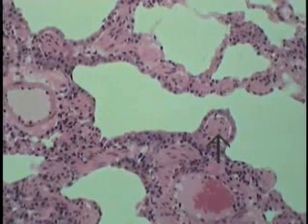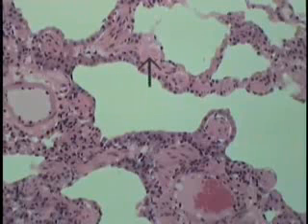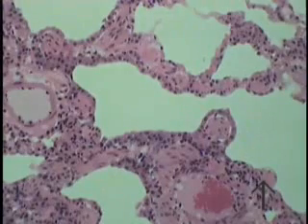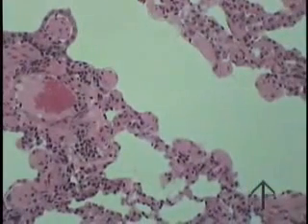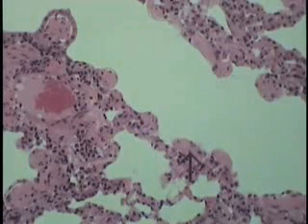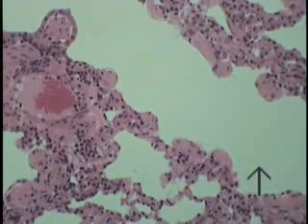There's another one here. This is a segment from an adjacent structure. There's another bundle of muscle here. And if we look on the upper surface, a bundle here, a little bit tangentially cut here. Here's that spiral cut several times. The one on the lower surface is cut here as it forms this open spiral. One forms here. And so you can see how this bronchial musculature is spiraling out and beginning to fade and disappear, and will finally end in the alveolar duct area.